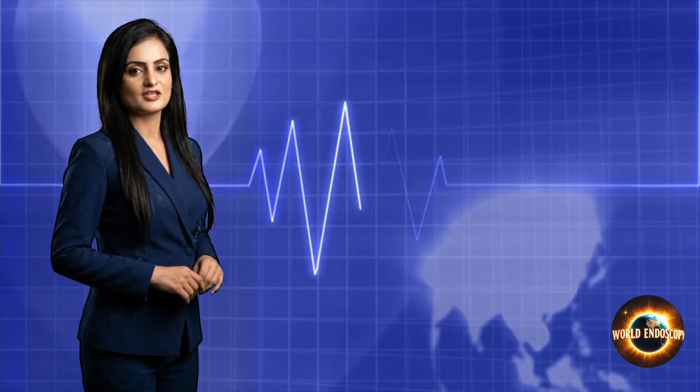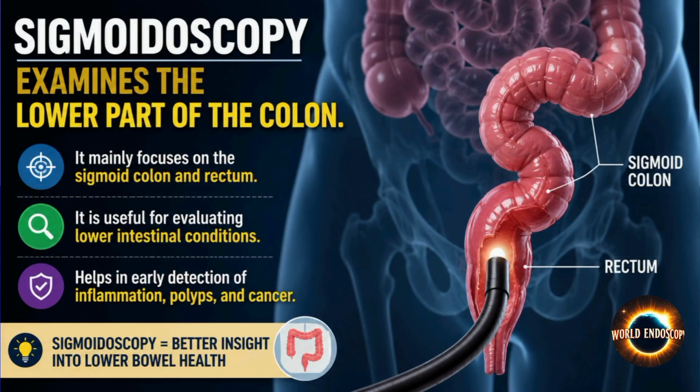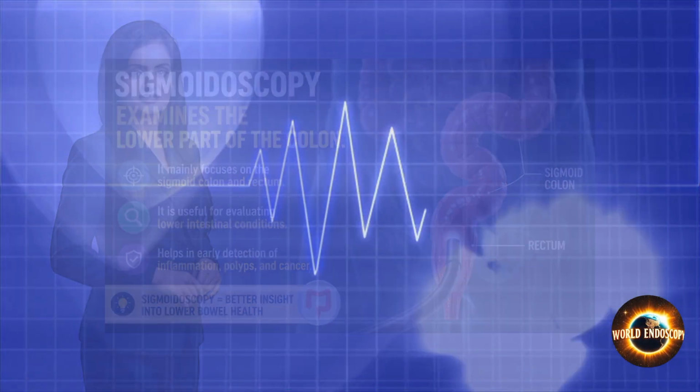Sigmoidoscopy examines the lower part of the colon. It mainly focuses on the sigmoid colon and rectum. It is useful for evaluating lower intestinal conditions.